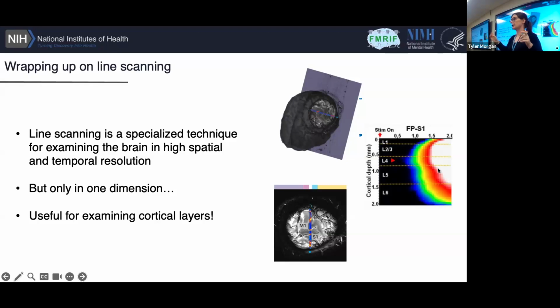And so the idea there was essentially to place 2 very sharp pulses that are not very wide, right at quarters, and then just blanket, get rid of everything else with some wider pulses that are less.